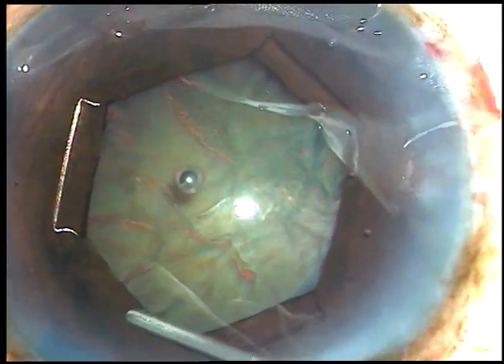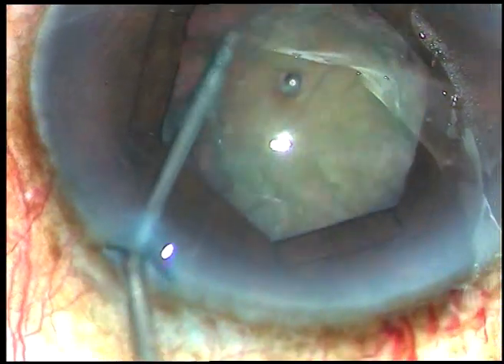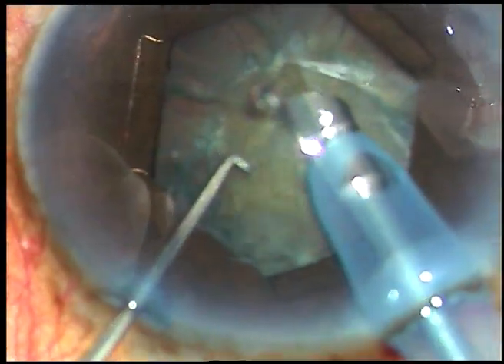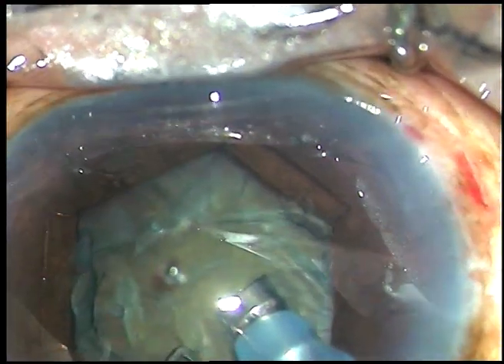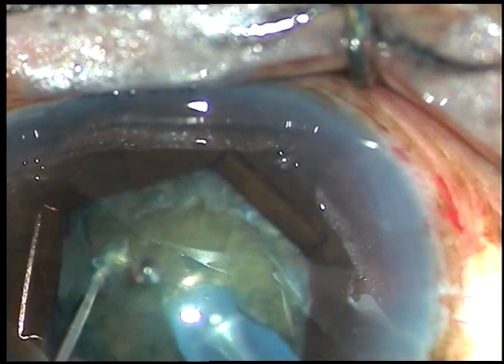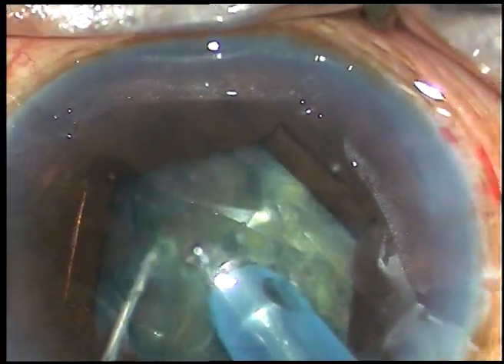Now I do hydrodissection. After hydrodissection, the nucleus is tapped posteriorly and it is rotated. Some more viscoelastic substance is injected into the anterior chamber. The tip of the phaco handpiece is introduced into the anterior chamber, and now I am going to do direct chop. Nowadays I do not make any trench — just bury the tip into the substance of the nucleus, hold the nucleus very firmly and chop it.